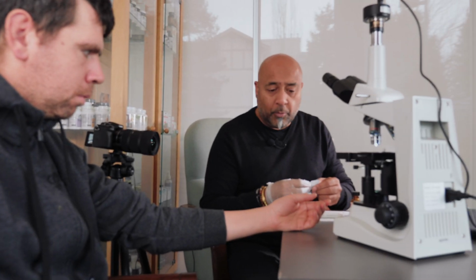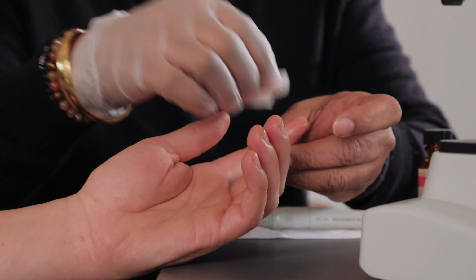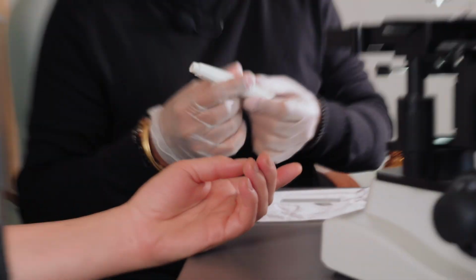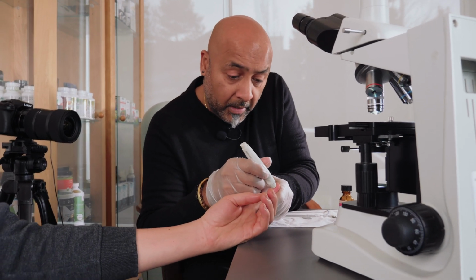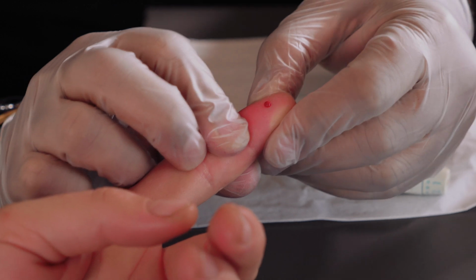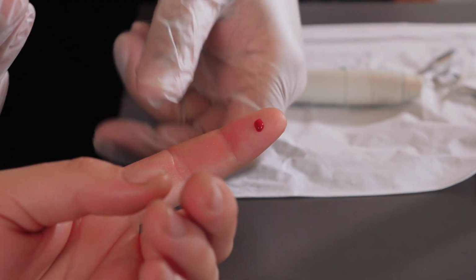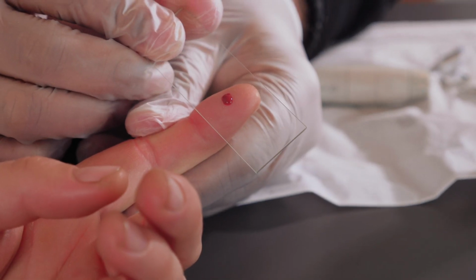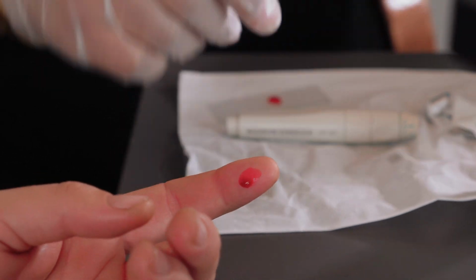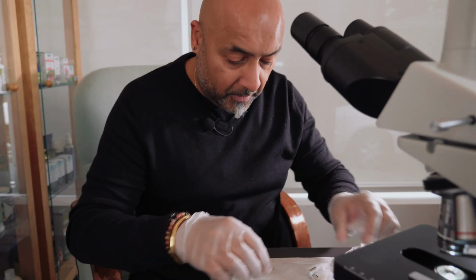So what I'll do is I'll explain to you what I'm going to do briefly. I'm just going to take 1 drop of blood from the finger, just 1 drop, and put it on the slide and we'll look at it. So let's start by just choosing perhaps this finger down here. Okay, so it's just going to feel like a little finger prick there. There we go. Beautiful. So just keep that finger like that for me. You okay there? Good. Excellent. So just hold that flat for me like that. Beautiful. That's all we need. I'm going to give you that, just apply that over that, put a small amount of pressure on there for me.